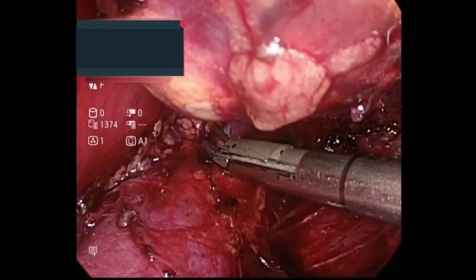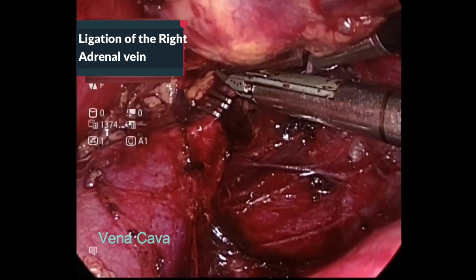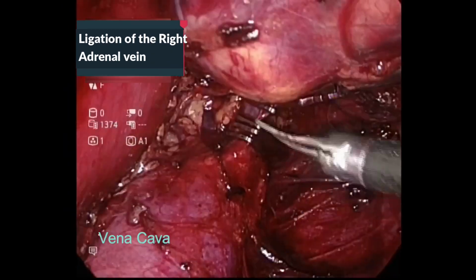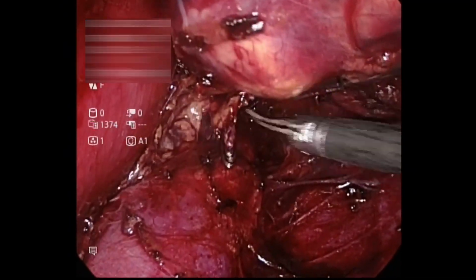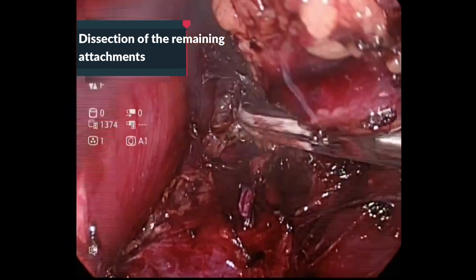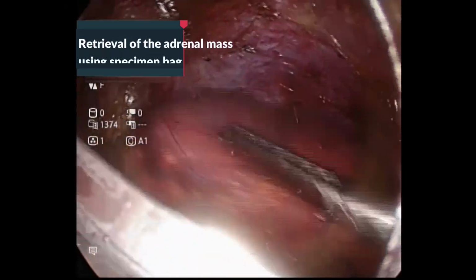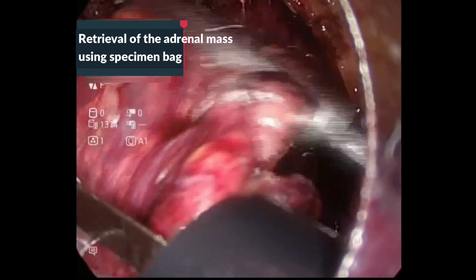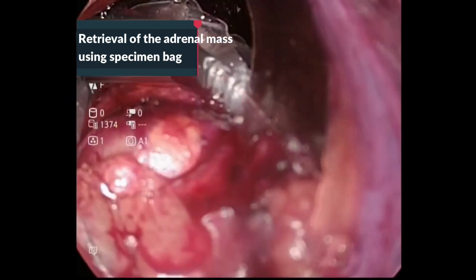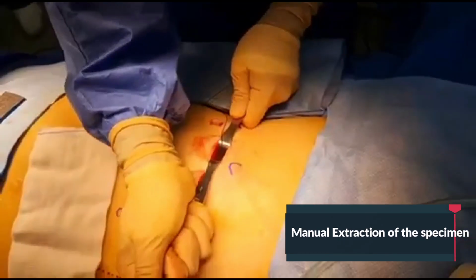It is followed by ligation of the right adrenal vein using ligating clips. A total of 3 clips on the patient's side was left. The remaining attachments were dissected. Once the adrenal mass is fully mobilized, it is then transferred to a specimen bag. Manual retrieval of the specimen was done, as well as withdrawal of the trocars.